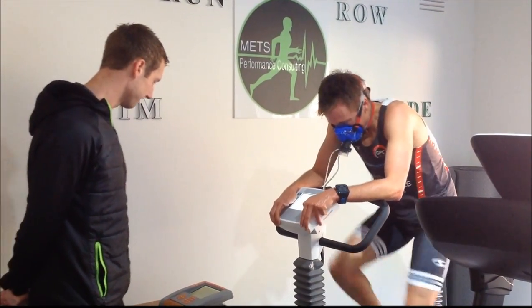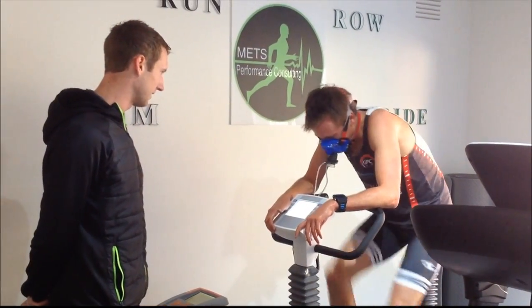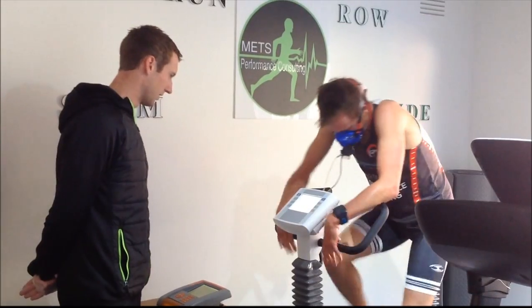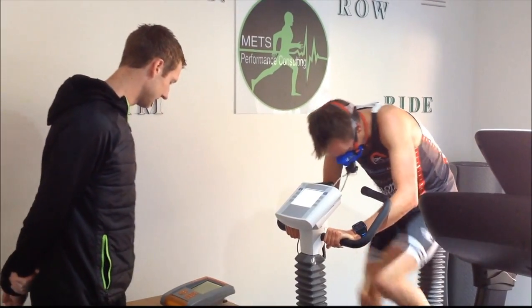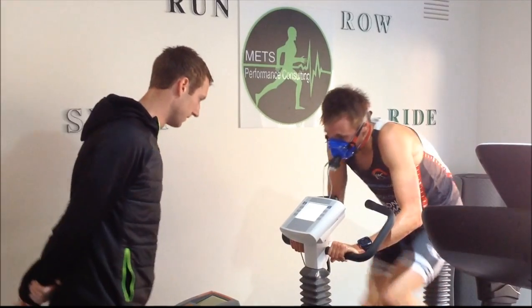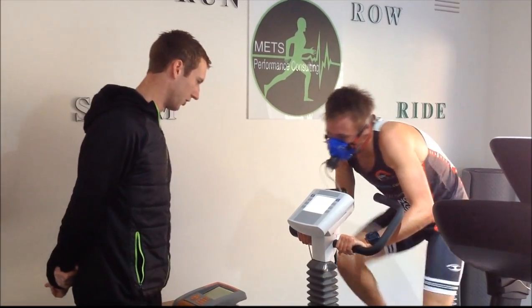50 seconds, come on. As much as you can, everything you've got. Come on, push. Come on, 15 more seconds. Come on, 20 seconds — 15 now, come on, finish it off. 10 seconds, come on. 5, 4, 3, 2, 1. Good work.